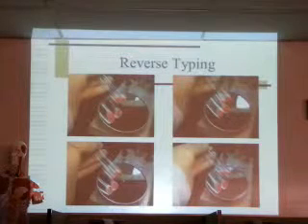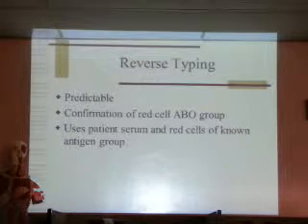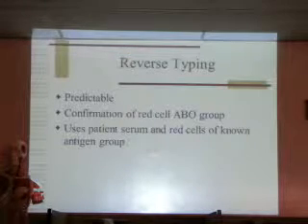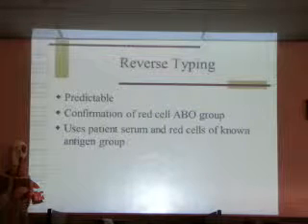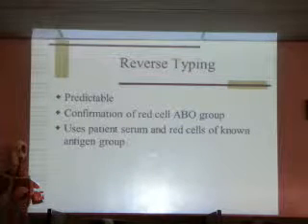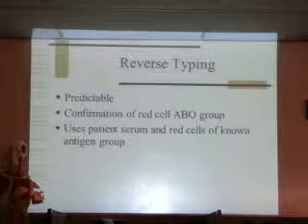Yes? Can you repeat how you actually did this again? Because you went just like my fast. Which one? The previous one? The first one you said, a little bit back. This one? And this one from here, so we're adding red blood cells to plasma? Your patient's plasma is added to reagent red cells. Your reagent red cells, you know that it's an A. You know that it's a B. You don't know what kind of antibodies are in your recipient. Not yet. And as I mentioned, you're using the reverse typing, which is adding your patient's plasma to reagent red cells, as a way to confirm the forward typing. So if I know what my forward typing is, I better darn well see an appropriate reaction going the other way.